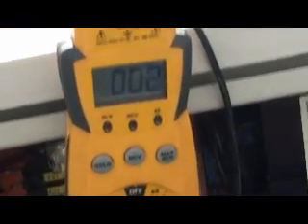I can also check my pump contactor. Top to bottom, 0, top to bottom, 0, top to bottom, 0. So all my contactors are in good condition, no pitting, and all the bolts are going through the contactor. Okay, next we have, let's see, input voltage of each phase, which I just did.